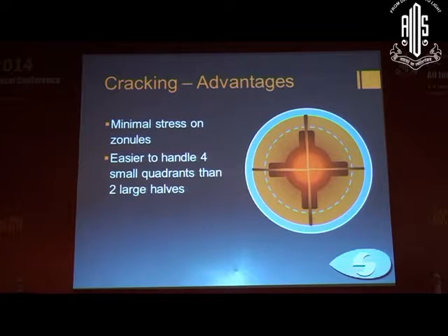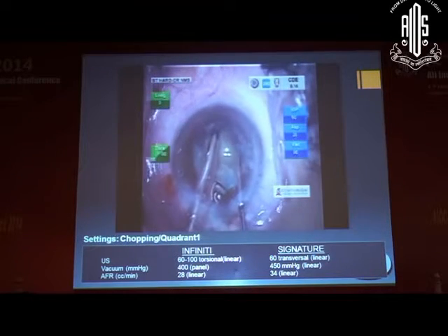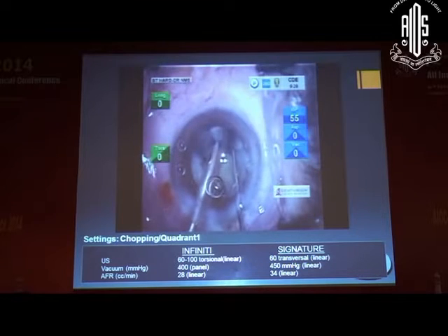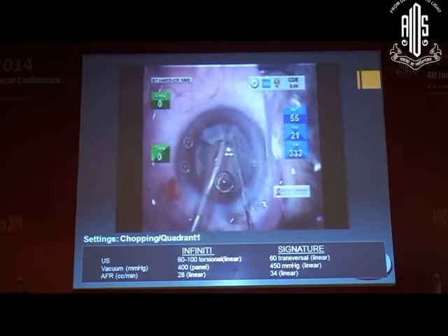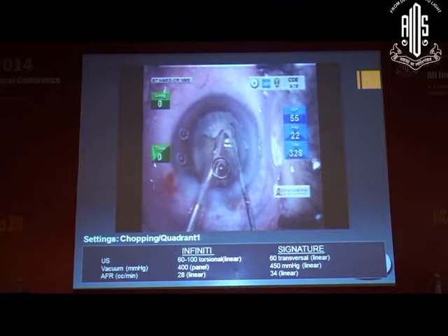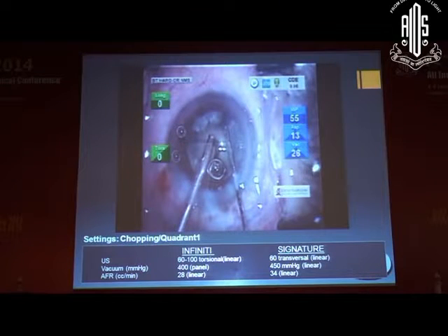The advantage of cracking is minimal stress on the zonules, and it is easier to handle four small quadrants than two large halves. As shown in the video, we go deep into the sculpted portion. Sometimes it is not easy to crack, so the second quadrant is chopped instead — although it is a four-quadrant technique, we are effectively chopping each half into a quadrant using high vacuum to hold and chop.